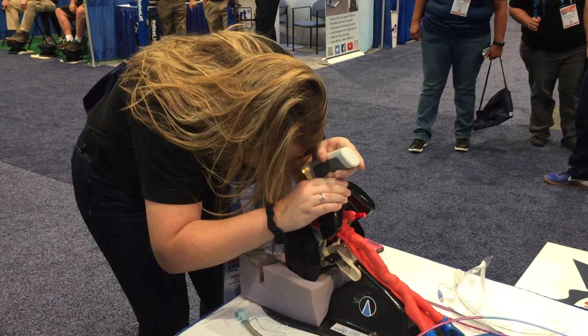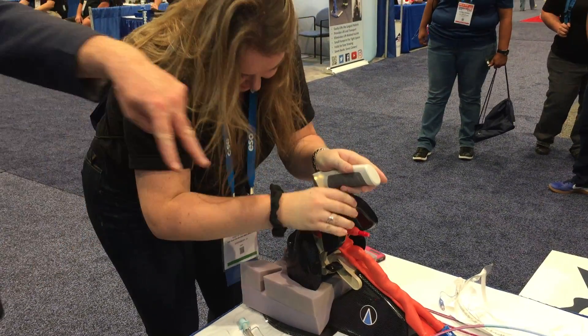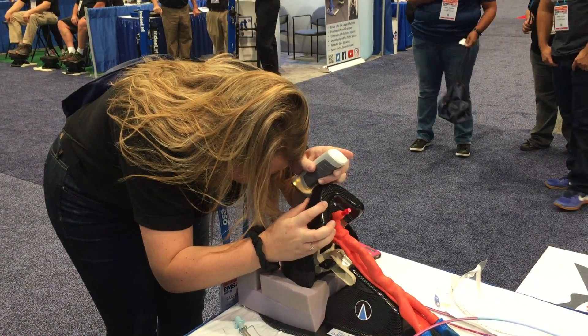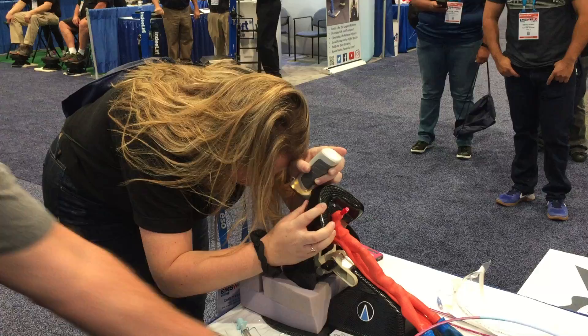You might see them — they should be like two white bands. Oh, I definitely need to see that. The two white things sitting up like this. Oh yeah, I see. I love it.